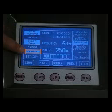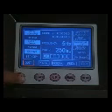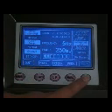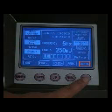Working status display: it displays the status of the laser. It will display 'Ready' if the laser can flash, and 'Stand By' if the laser cannot flash. Press the buttons Sim and Menu together to launch the machine, then it will be ready to treat patients after pressing the pedal.